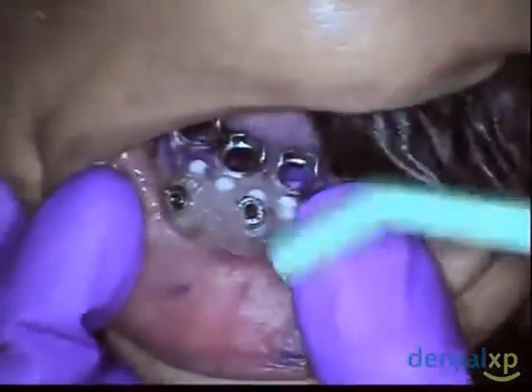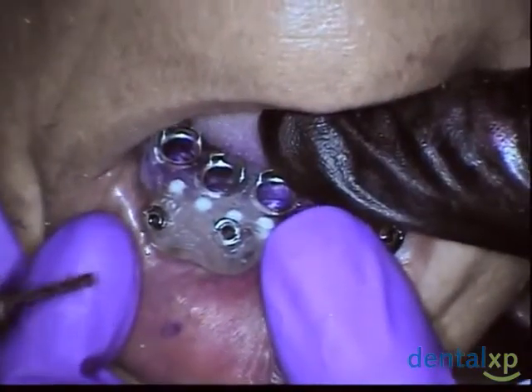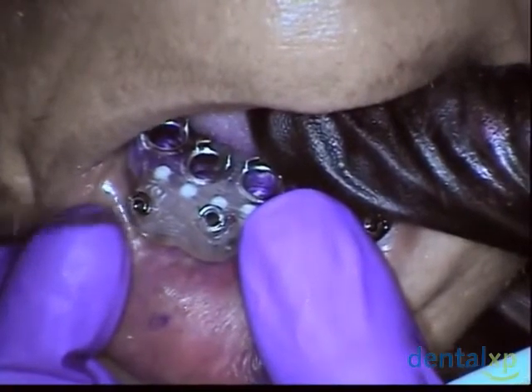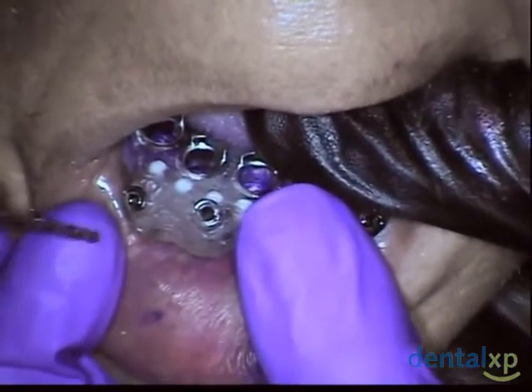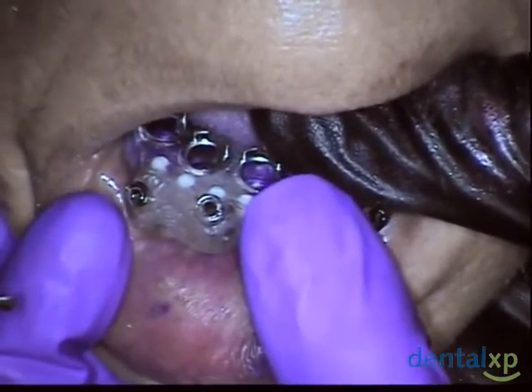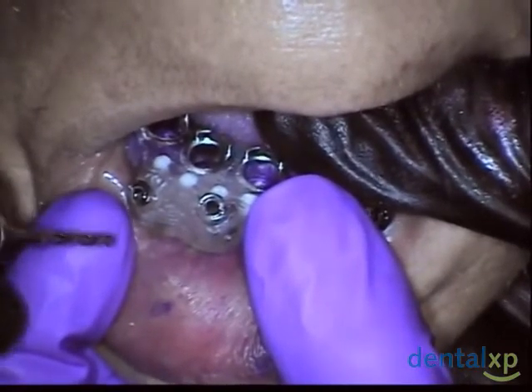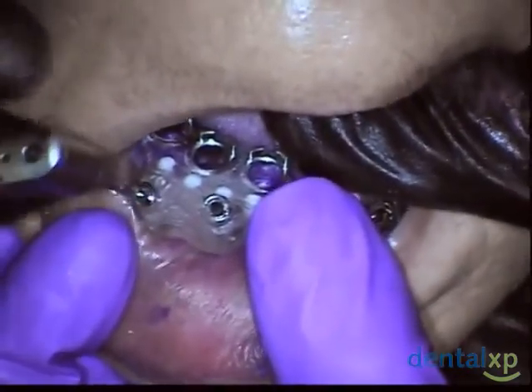People often ask what speed is needed, or can an endomotor be used for placing implants. The answer to the second question is no, because you don't have torque control. The answer to the first is a range — anywhere from 1,200 to 1,800 RPMs is acceptable by most people placing implants, with irrigation. I have torque all the way up when doing osteotomies. I turn the torque down to 35 newton centimeters when delivering the implant, because that's the maximum force I'd like to place on the bone-implant interface.